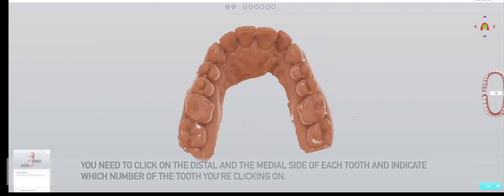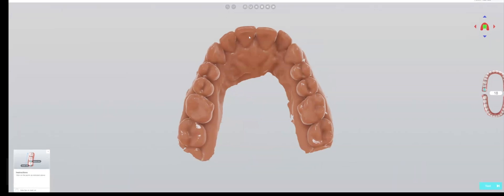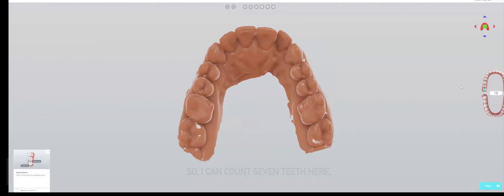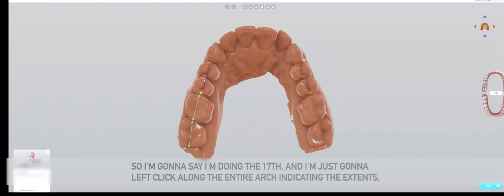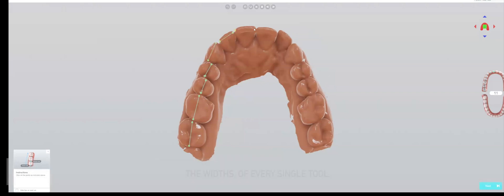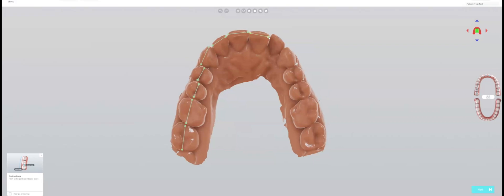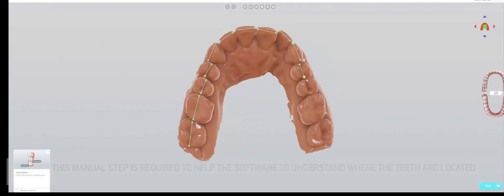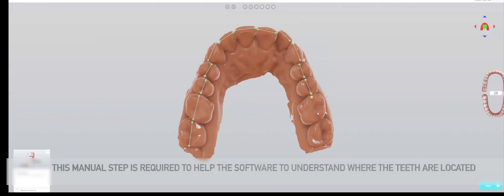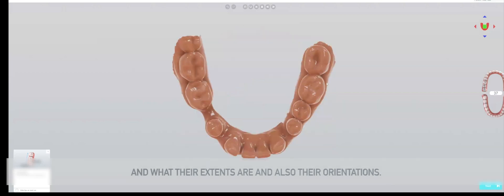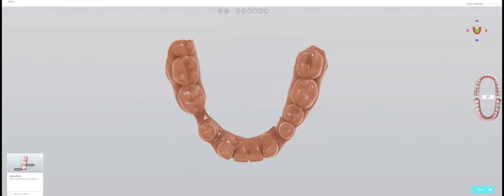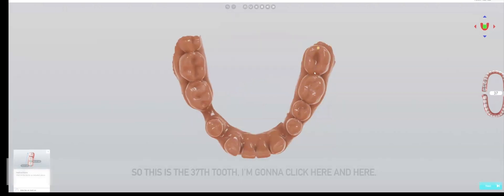The little hint on the bottom left shows you where you need to click. You need to click on the distal and mesial side of each tooth and indicate which number of the tooth here. I can count 17 here, so I'm going to say I'm doing the 17th and just left click along the entire arch, indicating the extents and width of every single tooth.